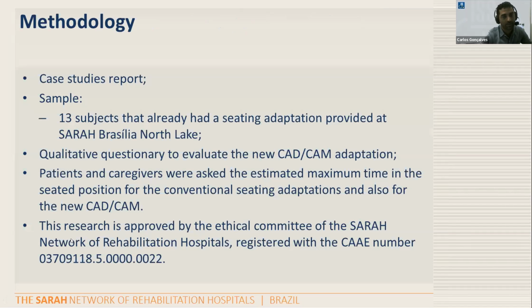So we would like to go deeper in the subject. So we created a case studies report. We acquired a sample of 13 subjects that already had a wheelchair adaptation made entirely by hand and needed a new one because of changes in the wheelchair, growth, and so on.